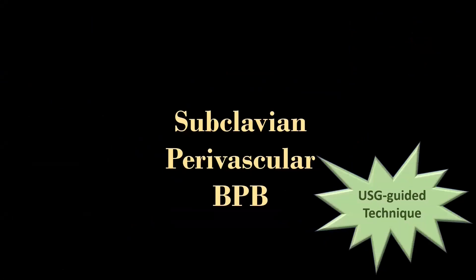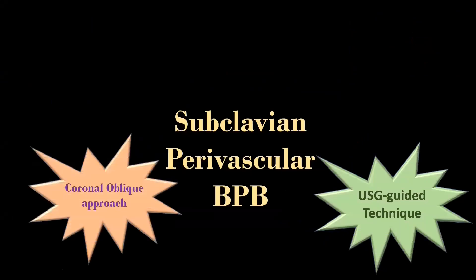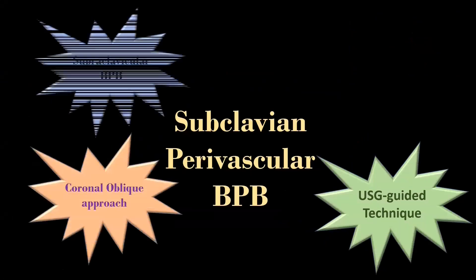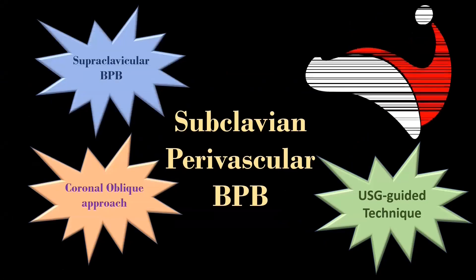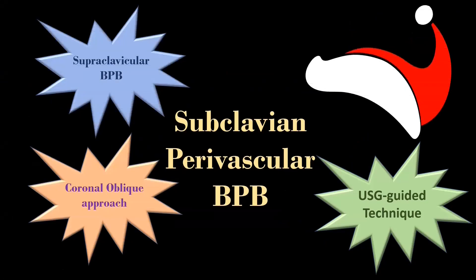I am going to demonstrate the ultrasound-guided coronal oblique approach of subclavian perivascular or supraclavicular brachial plexus block, based on the phrygian cap or liberty cap pattern.